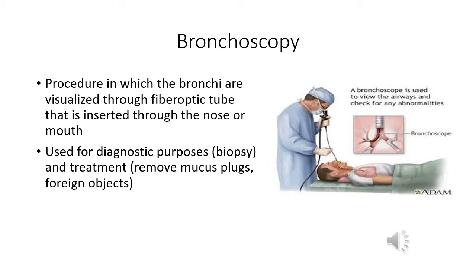A bronchoscopy is a procedure in which the bronchi are visualized through a fiber optic tube that is inserted through the nose or the mouth. It is used for diagnostic purposes, such as biopsy, or treatment, such as removing mucus plugs or foreign objects.